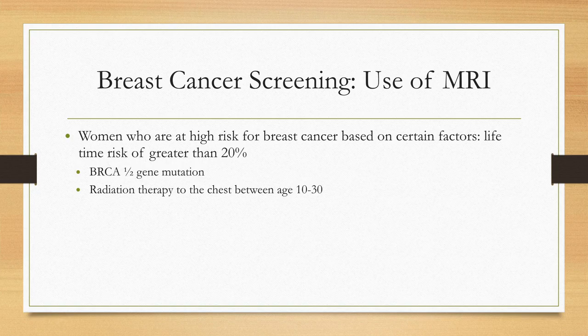And then breast MRI is also used for screening. Some people may be familiar with MRI as far as breast cancer after diagnosis, but it's actually becoming more and more used for screening. Currently, they recommend it only for patients with greater than 20% lifetime risk of breast cancer. So that is patients with BRCA1 or 2 gene mutation, patients that maybe had lymphoma when they were younger and had radiation therapy, and other genetic syndromes.